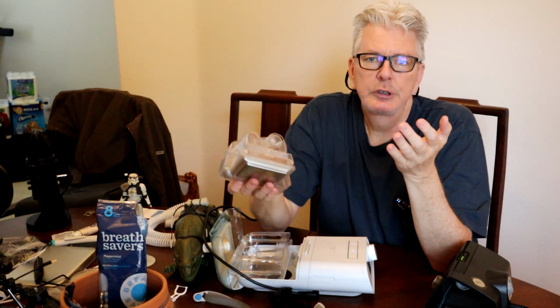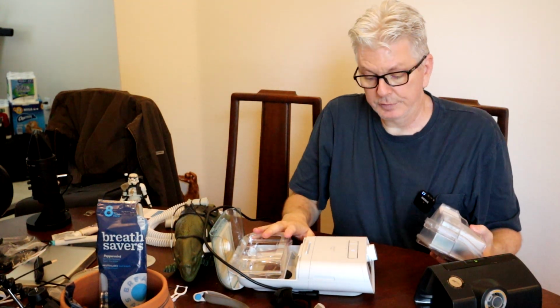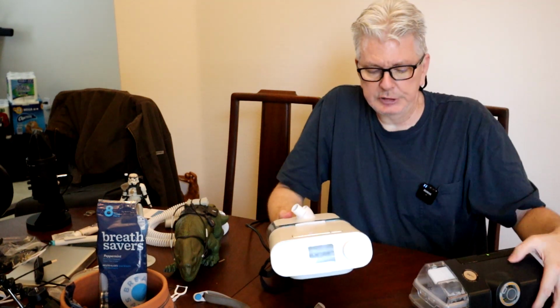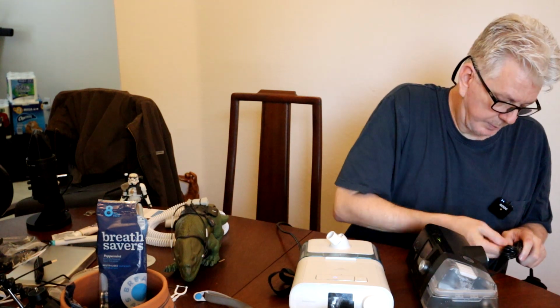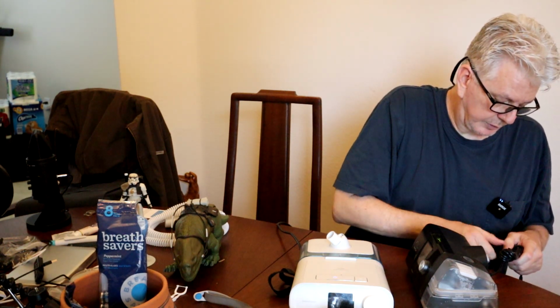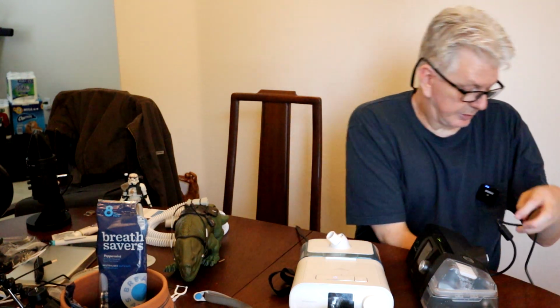So for each machine, each water chamber, there are pros and cons. Again, I like the design of the Philips a little bit better, but this one seems a little sturdier, so it just depends on what you like. Size-wise, like I said, the Philips is not as tall as the ResMed, but the Philips is a little wider. So you have to just kind of think about where you're putting it next to your bed at night, and if it makes a difference to you. I mean, they both take up roughly about the same amount of space altogether.